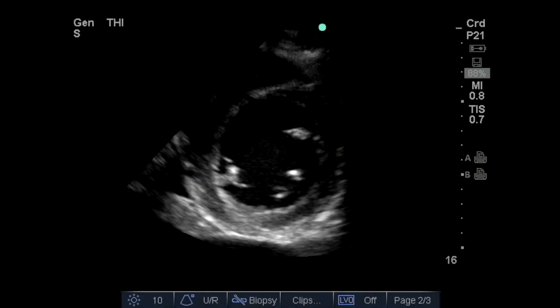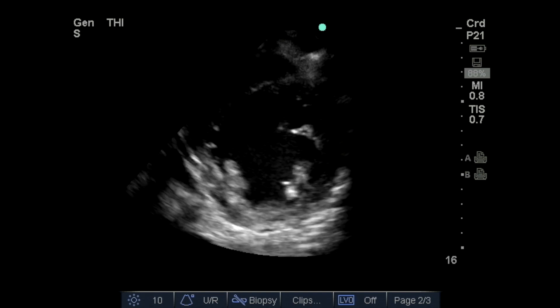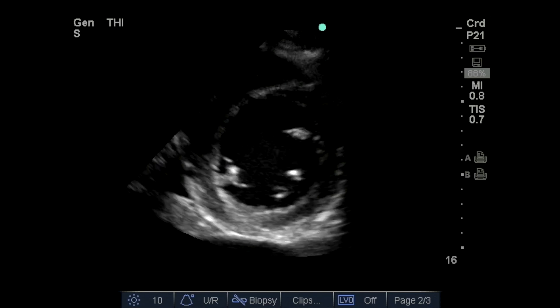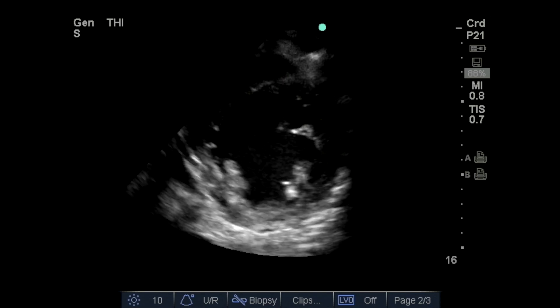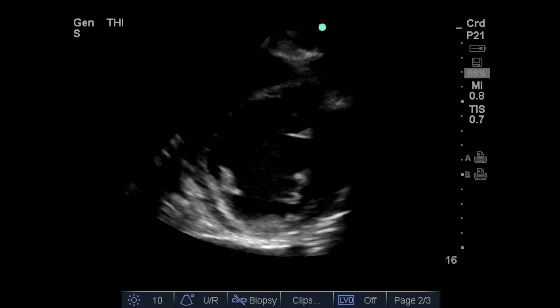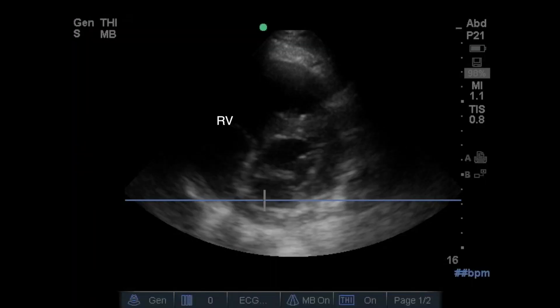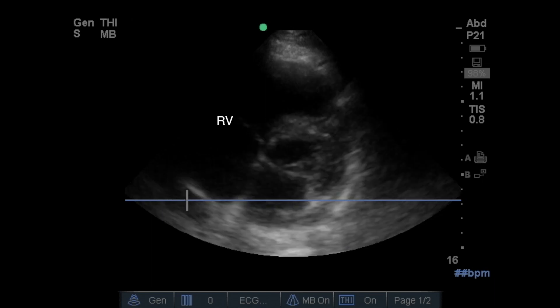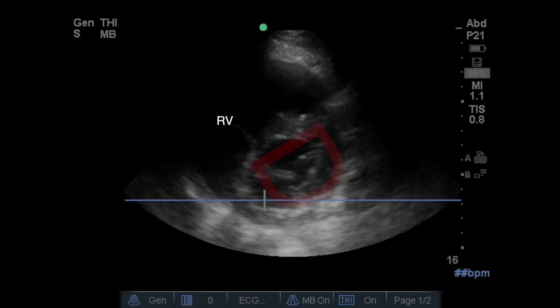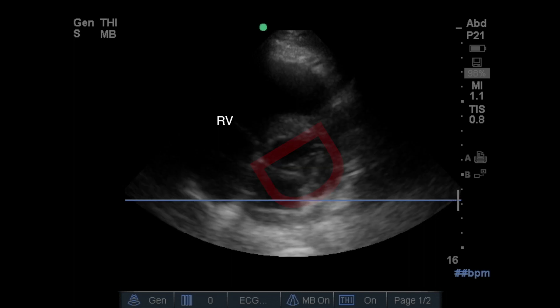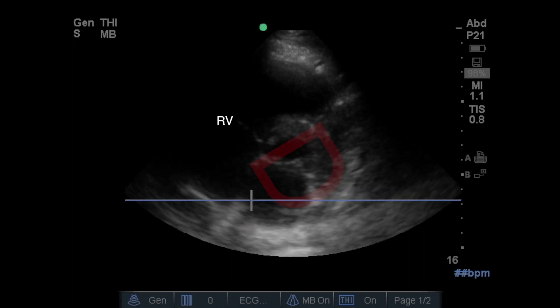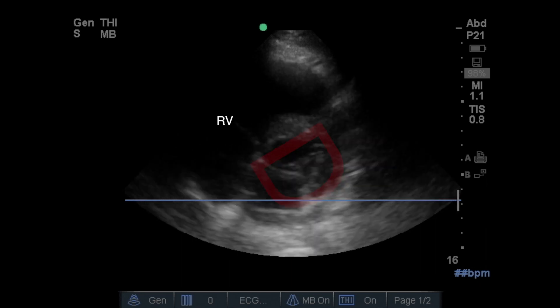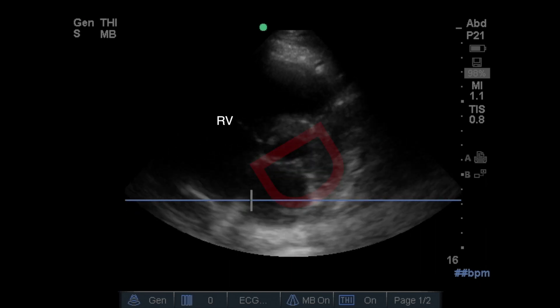Here are several clips of abnormalities identified in the parasternal short axis view. In this first clip, we can see significant left ventricular dysfunction with the identification of a hypokinetic left ventricle. In the second clip, we see an example of right ventricular dilatation. The so-called D sign is outlined here. Care must be taken that the view is not taken in an off-axis angle, as you can get a false D sign appearance.